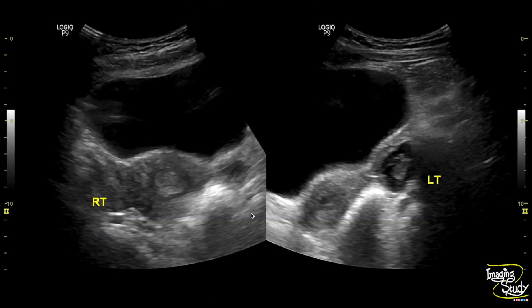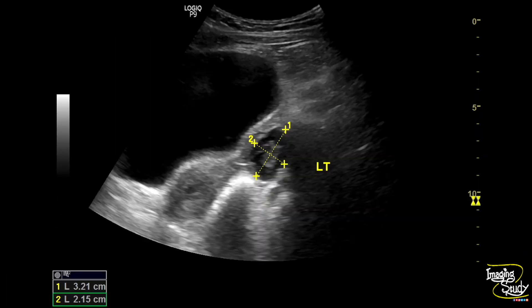Here's the picture — you can see the transverse section of the uterus. This is the right ovary, and on the left you can see the cystic area that is the gestational sac. Here you can see a hypoechoic area, which should be the embryo. We have taken the measurement of the cystic lesion, which was 32 by 21 millimeters.